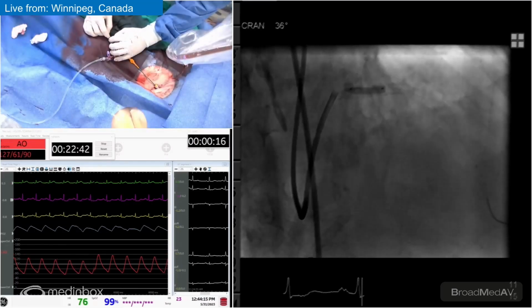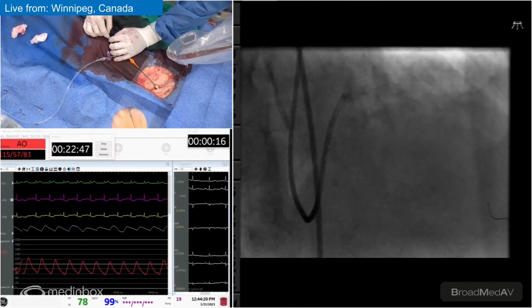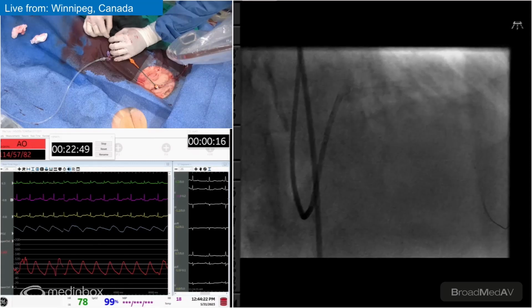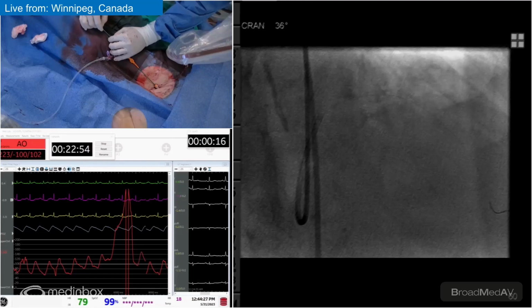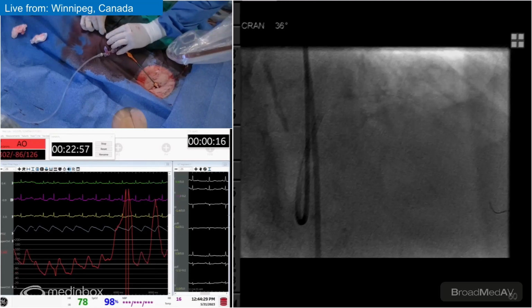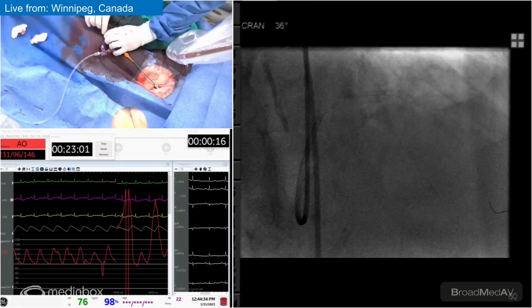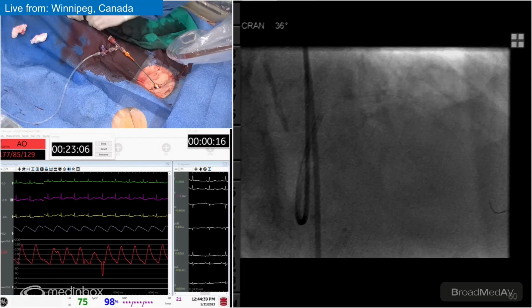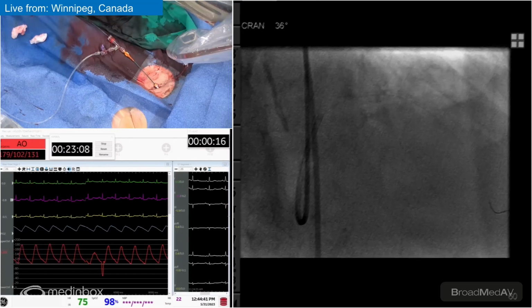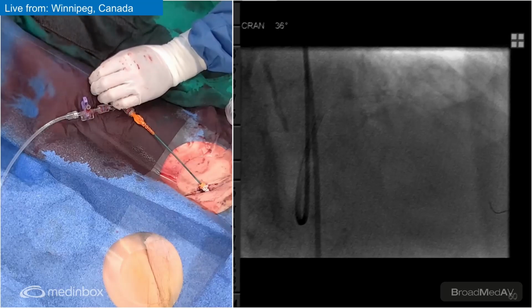Just looking at the vessel here. The vessel up top is about... should we attempt an IVL just to make sure, or shocking? Because it's not circumferential calcium, I don't think IVL is going to help us much. I don't think so. It's nodular, right? It may not help you much. So we're getting about 4 by 3.2 there. It's probably going to be bigger than that.